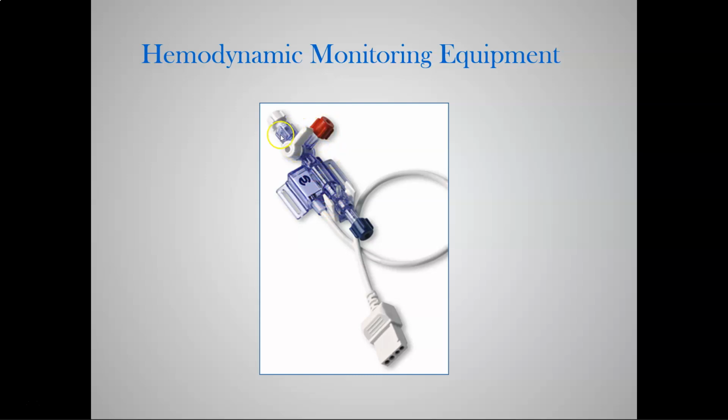This is our three-way stopcock. Here's our electrical hookup to the monitor. And typically there would be tubing attached to both ends. Looking at this one, the blue one is going to the patient. The white one would be going up to the bag of NS or heparin. And then this one has how we open these three-way stopcocks to atmospheric pressure. We're not removing the red cap. We're going to keep that in place.